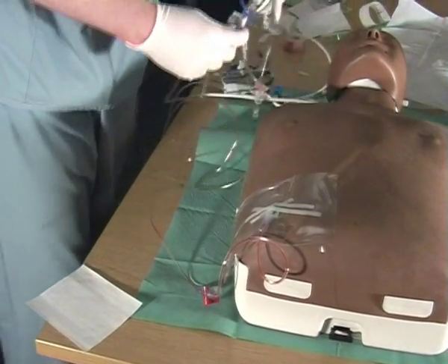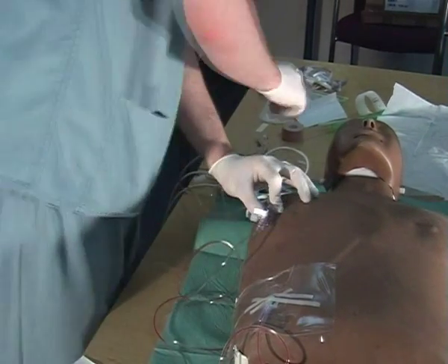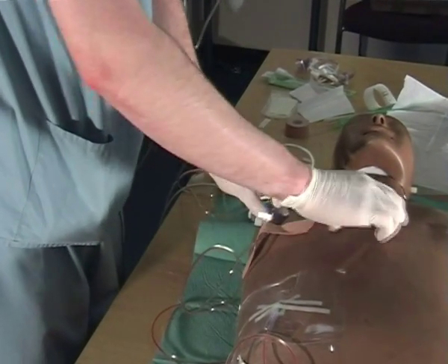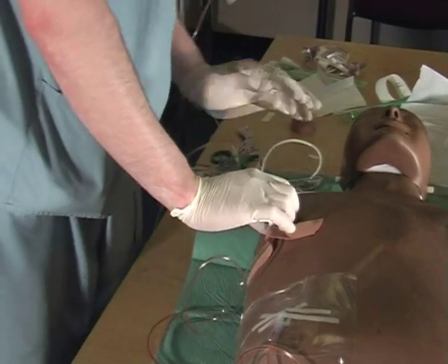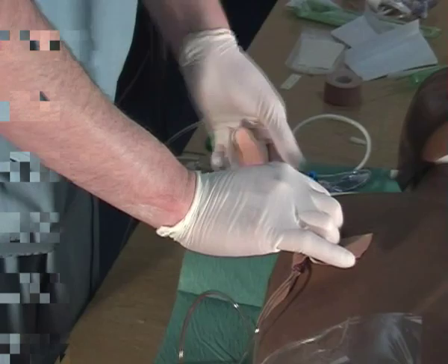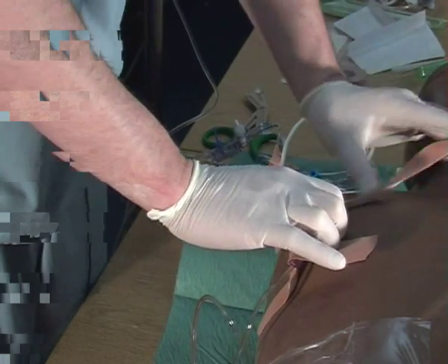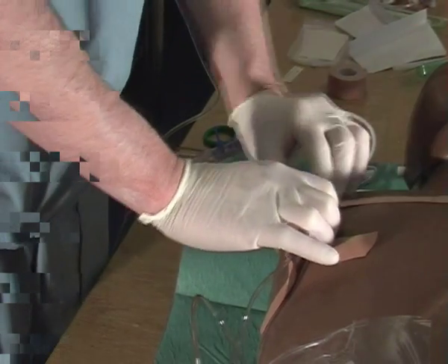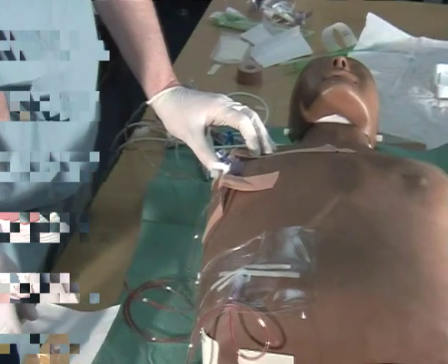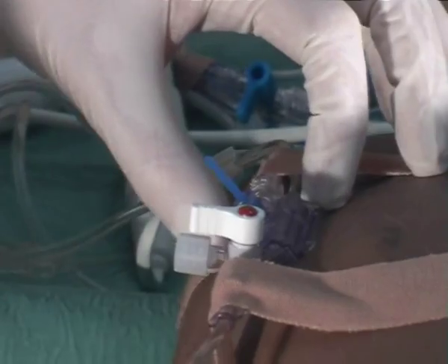Get your junction box and secure it at heart level. Secure with tape — one piece at the top, one at the bottom. We are now going to zero the arterial line from the main junction box we have just placed onto the patient's chest.